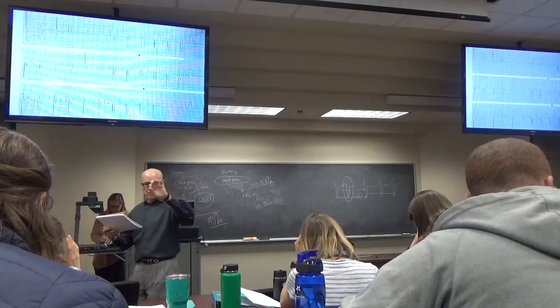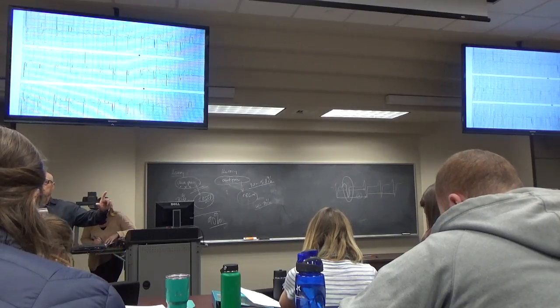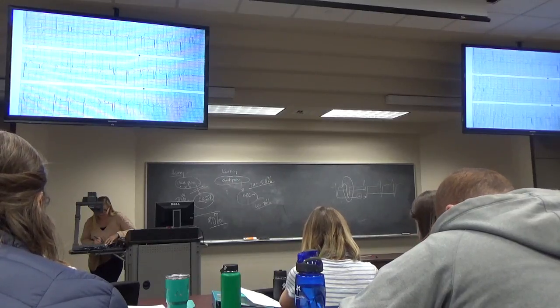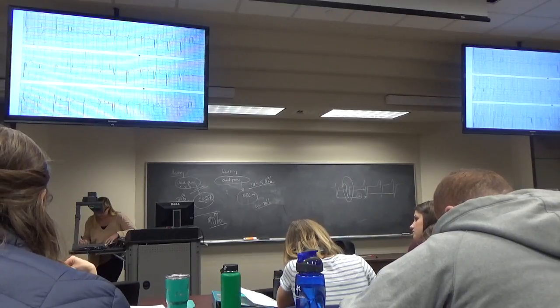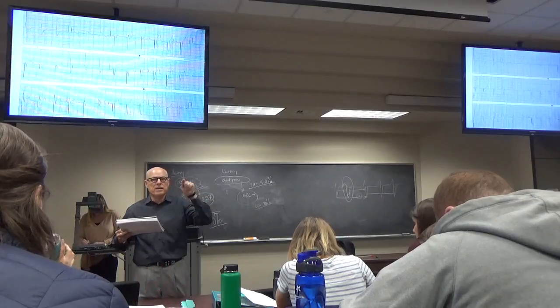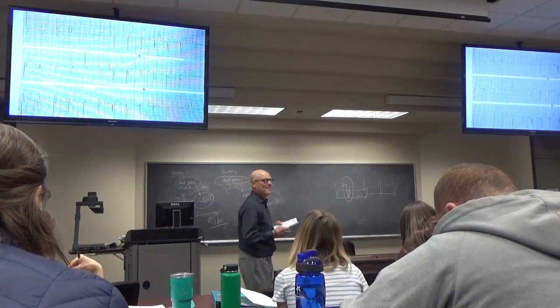So let's stop there for a second. What is striking when you look at the EKG? What jumps out of the page that you've never seen? Huge Q waves. It's weird looking because it's so narrow and so straight. Yes, it looks weird because it is weird. And it's an artificial thing. Something artificially is caused. Yeah, I saw that question in the notes and I couldn't tell which ventricle, about the pacemaker. I was like, I've never seen a pacemaker rhythm before.